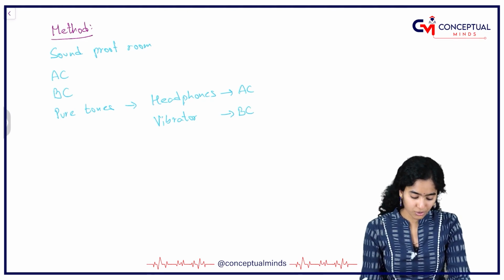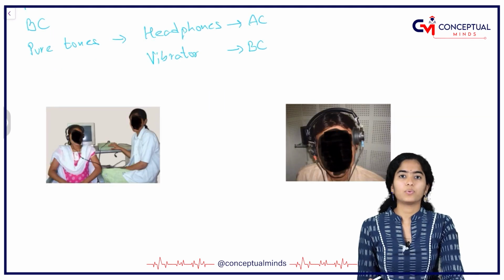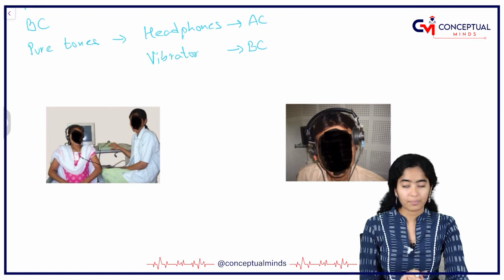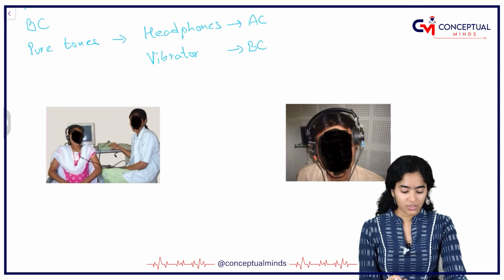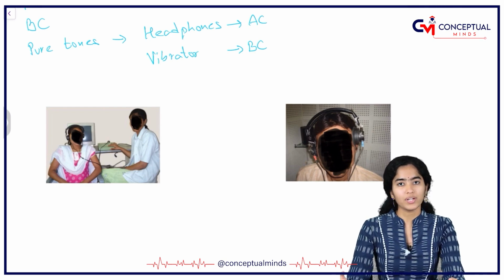Let me show a picture of how this entire setting looks like. So this is how it looks. In the first picture, you can see that both the examiner and the patient are sitting in the same room. The examiner is using a machine, the audiometer, and the patient is connected to headphones. Via the headphones, sounds are transmitted and the patient will respond.